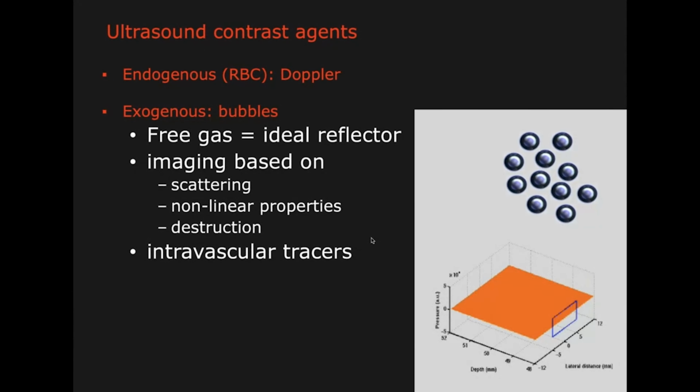Okay, so last, very, very briefly, we're not going to go in a lot of detail here because in clinical reality, it's not that important. But what we said before is that every imaging modality has contrast agents, which can actually be used in order to improve the visibility of structures that we don't see well. In ultrasound, typically blood is black, it doesn't reflect well. So if we want to see blood in more detail, what we need to do is add to the blood a substance that would reflect a lot of ultrasound, as a contrast agent.